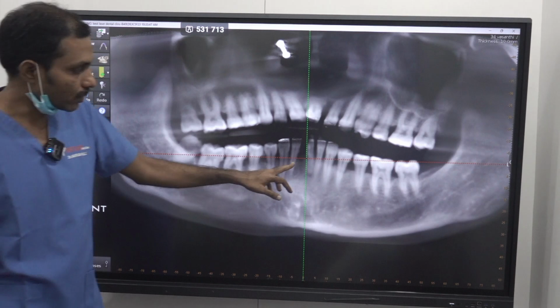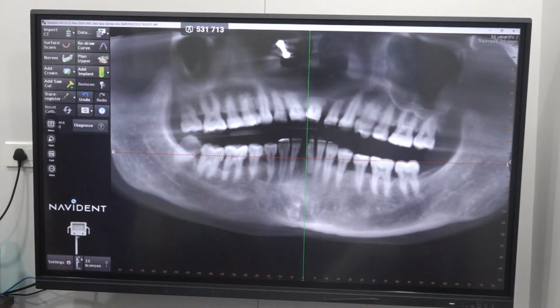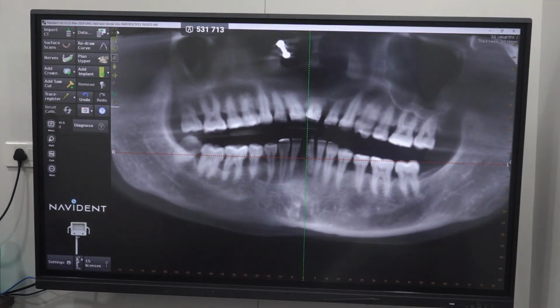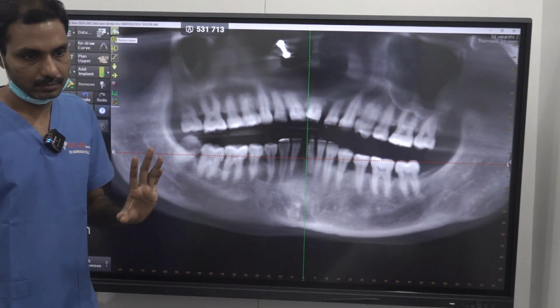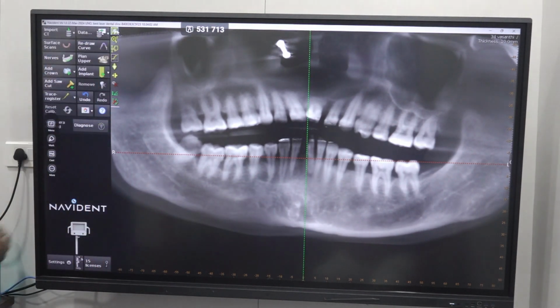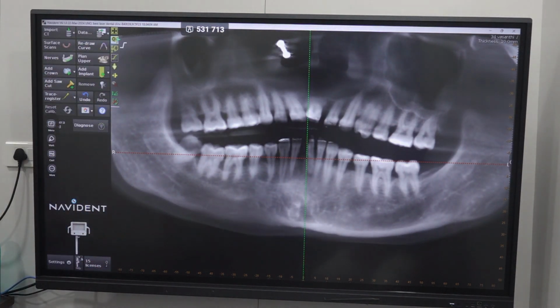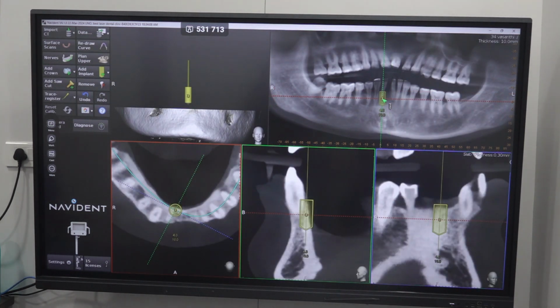So if there is severe perio pocket infection, better to select a basal smooth surface. So this won't give you an idea about length. By seeing this, you cannot determine length. Only 2 options: either take CBCT or determine it during surgery. Even if you take CBCT, during surgery you have to respect the resistance and determine the length. So for 4-2, we'll be planning now.